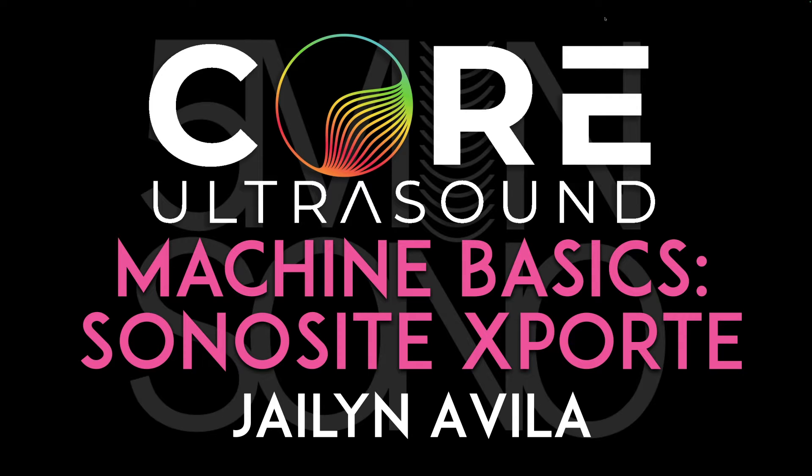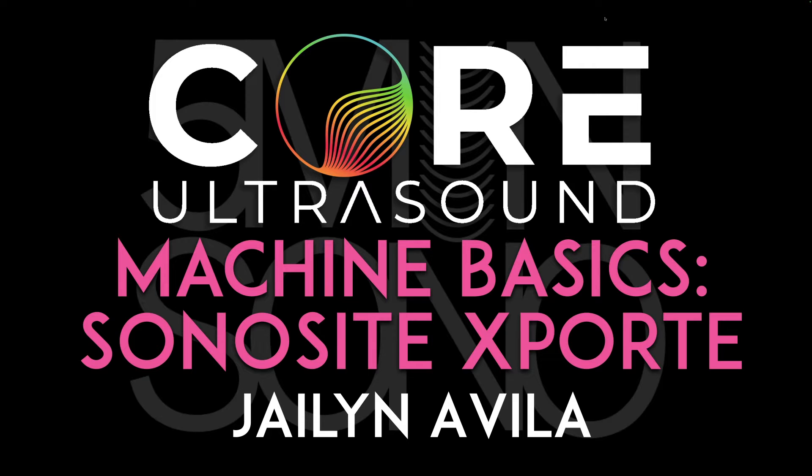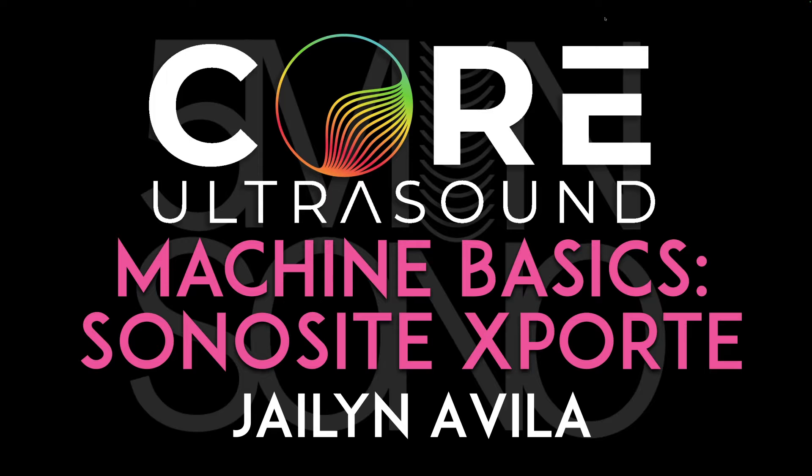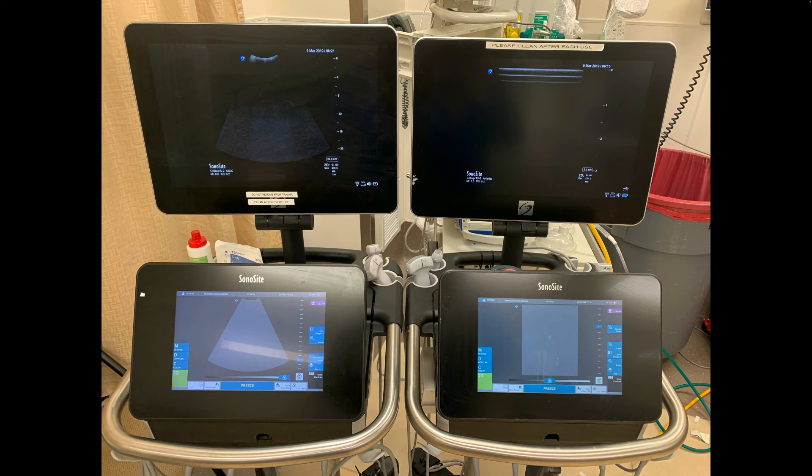Hello, my name is Jaylen Avila. And in this five minutes of video, we are going to start a new series where we just talk about how to operate machine basics. We're going to start off by using a quite commonly seen machine, the Sonosite export.